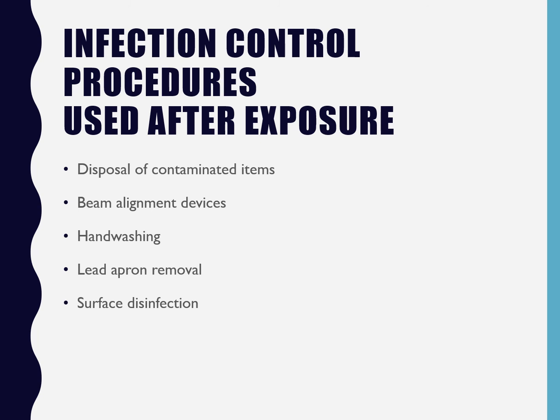What have I not said? Make sure that the lead apron is only touched with clean hands. Lightly spray things before rewrapping. So at our clinic, you would not rewrap anything. You leave it unbarriered so that the next person who comes in to take radiographs, if everything is clean and unbarriered, then they know it's clean.